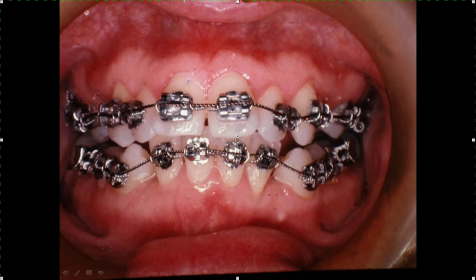You can also come in with intrusion wires. If you want to lower these teeth right here, you put this thing on - the intrusion wire will be way down here, even lower. Bring it up and hook it to these teeth up here, and it'll have these teeth lowered down and open the bite by the time you get the others straightened out. You do it real quick. Whereas if you're waiting for a single wire to do this, you've got to wait until they're lined up and you can hold a heavy enough wire to intrude them. The double wire and the intrusion wire really speeds up treatment - you can put that on day one.